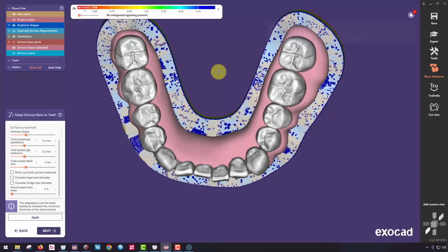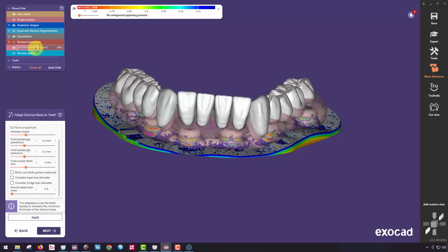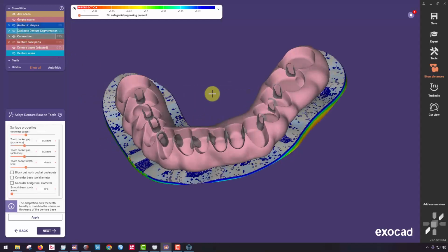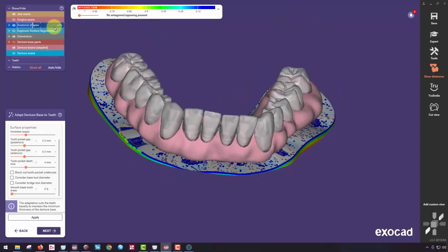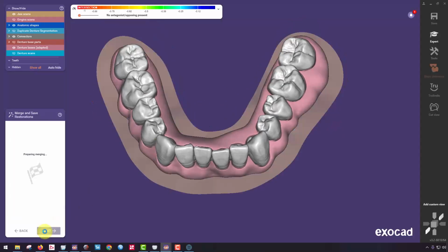Now my computer's done. I've created those pockets all the way around my prosthesis very effortlessly. And I'll go ahead and take a look at where my denture base is. Here's my denture teeth. Here's my denture base. So if I turn off my anatomic shapes, that'll give me a little bit of a preview of what my pockets here look like. So I'm not there yet, so don't get too caught up on how this looks, but this is the general look of what it should look like. Now click the next button.